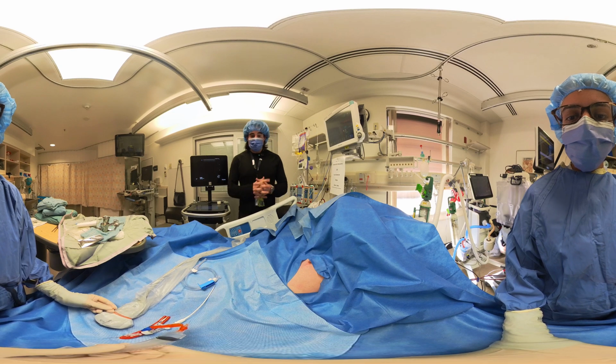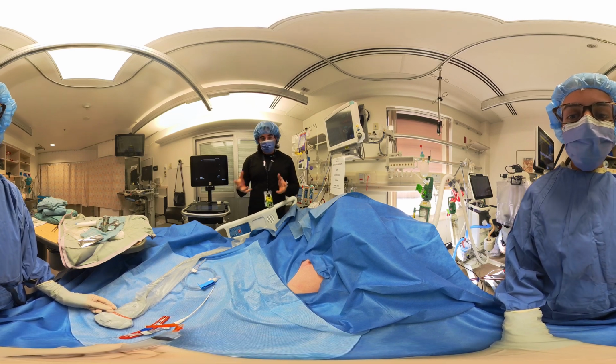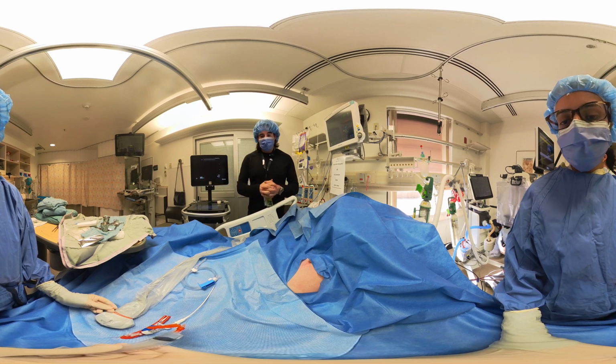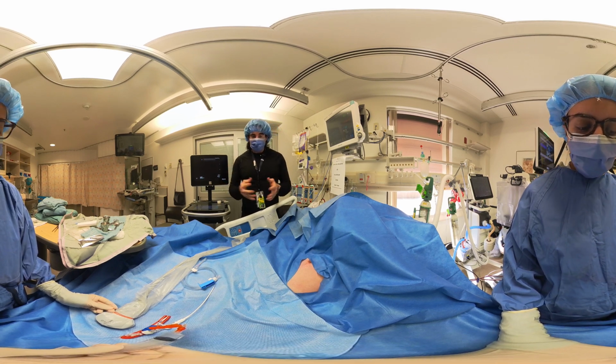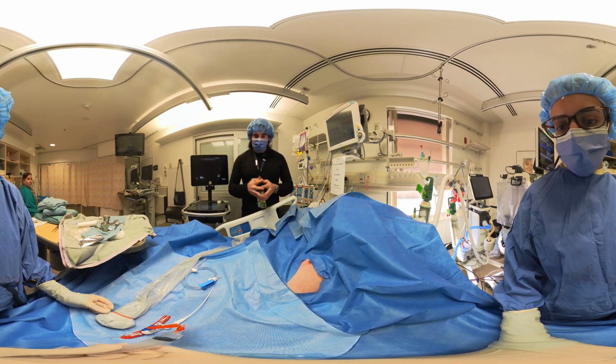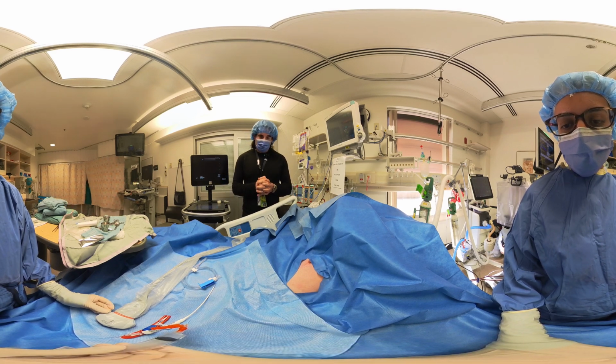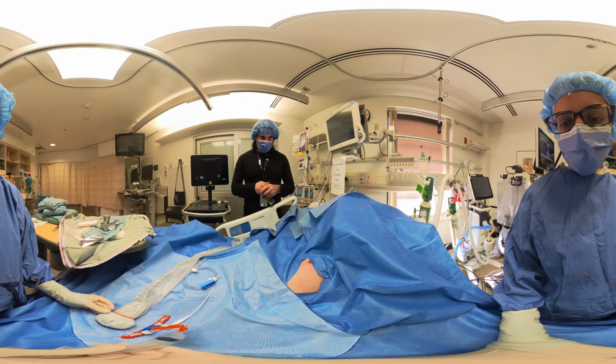Okay, so you have now prepped and draped the patient. This is how we prepare and drape in the intensive care unit. If you're in a clinic, you might drape differently, maybe with a limited drape, either green towels or a paper drape, for example. But here we're taking full sterile precautions. The area has been prepared with a chlorhexidine solution. We've draped the area now.